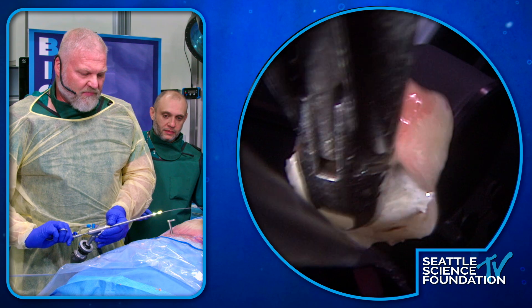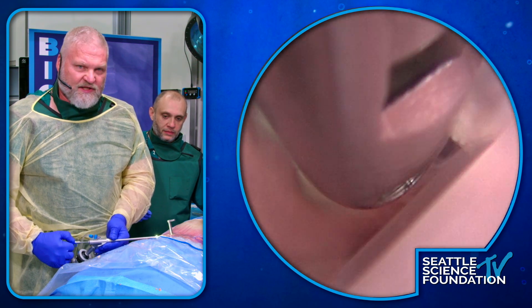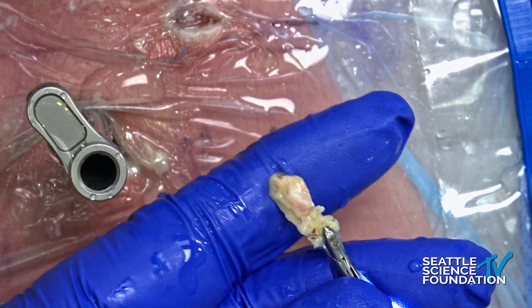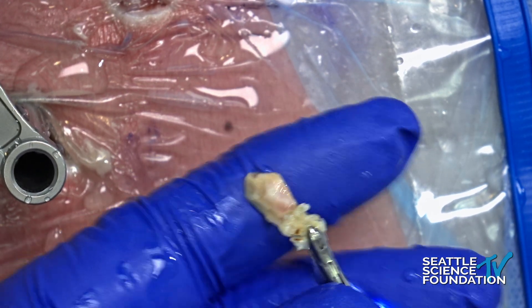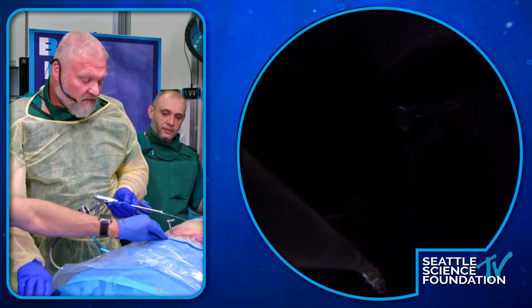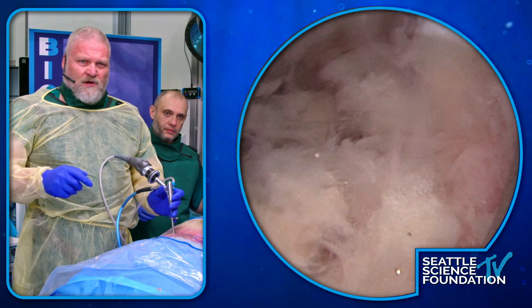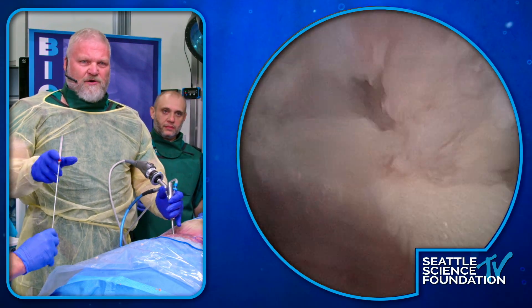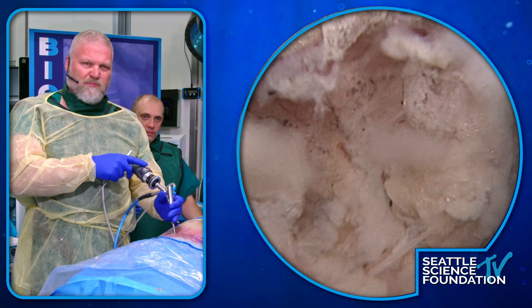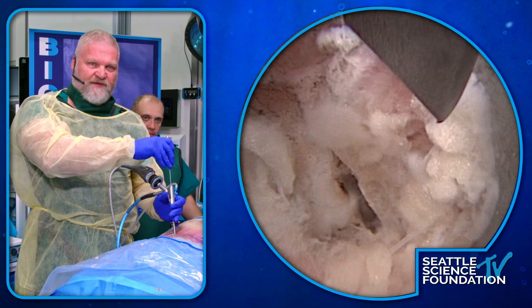You see the piece of bone and ligament that we got out. When you're trying to bite ligament, you leave the piece of bone attached to the ligament like this, grab the piece of bone, and the whole ligament comes out with it — makes it a lot easier. You do have control when you're going through because you can feel when the osteotome goes through the back side of the bone.